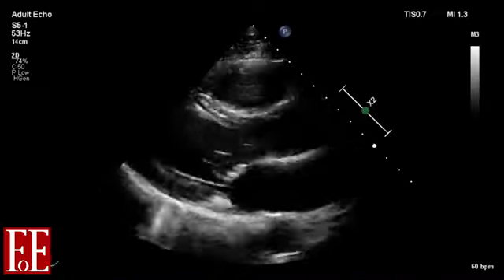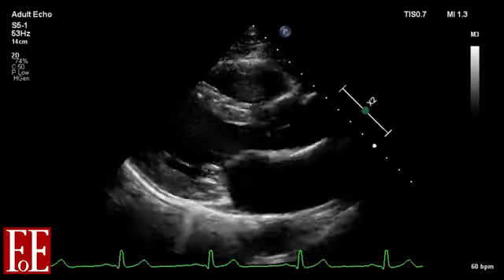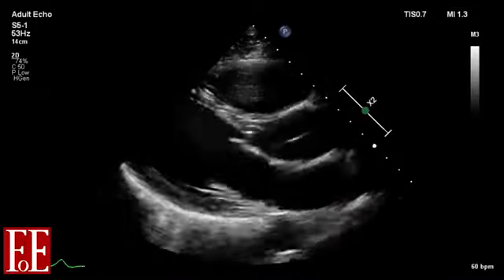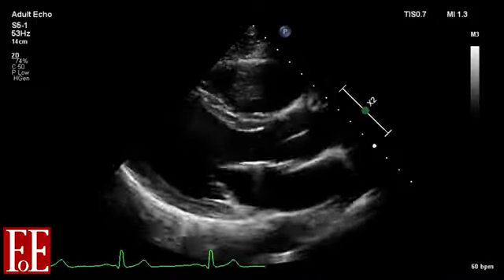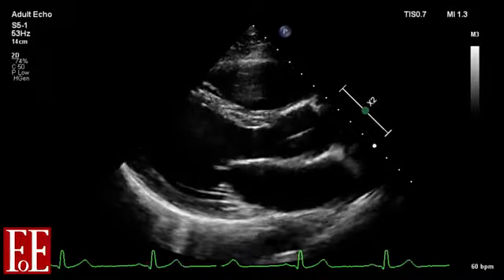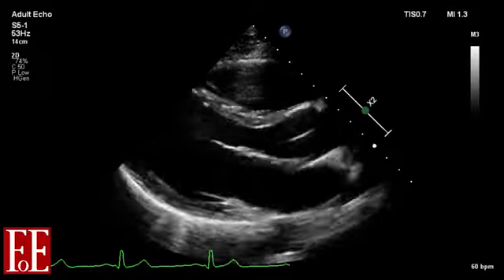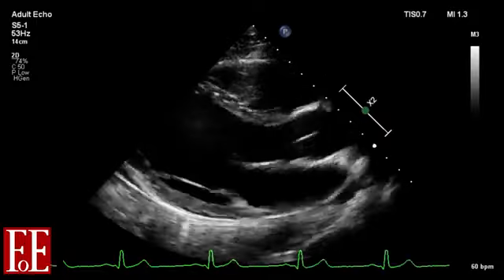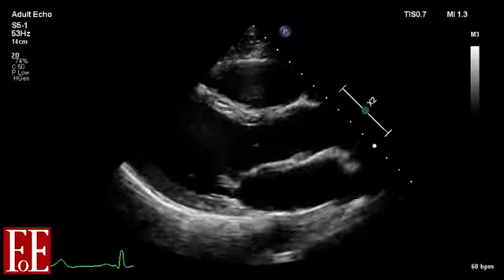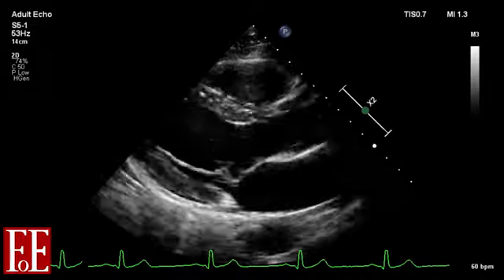Next we're going to take a look at the aortic and the mitral valves. What we're looking for in the valves is the leaflet thickness, whether they open well, whether the leaflets come apart and allow blood to flow from the first chamber into the second, and whether or not the leaflets close together, they coapt nicely, and whether or not they fall back beyond the annular plane, so whether there's any prolapse or flail segments. It's beyond the scope of a level 1 study to exclude infective endocarditis, but you may well see vegetations on the valves, and you should keep an eye open for those.